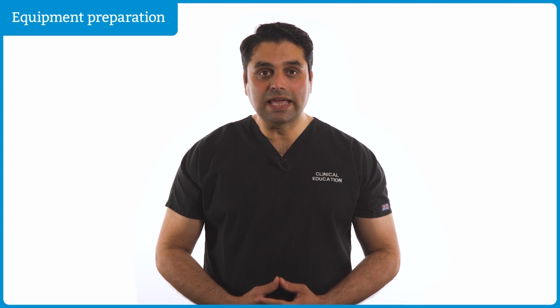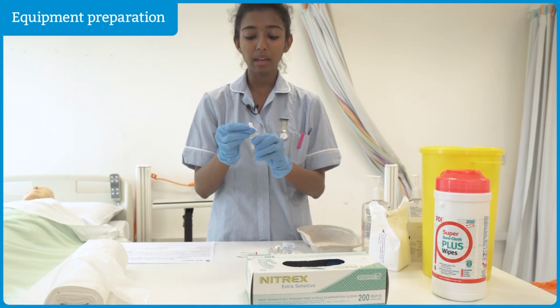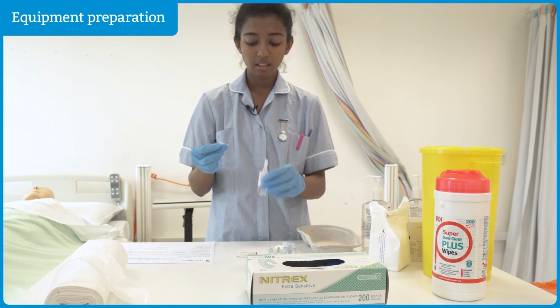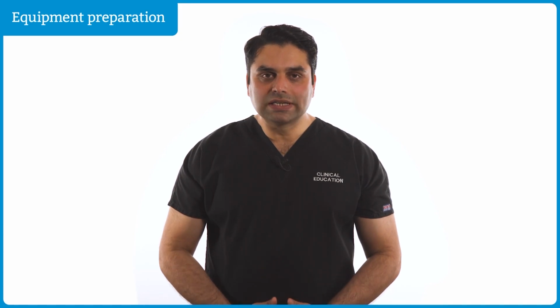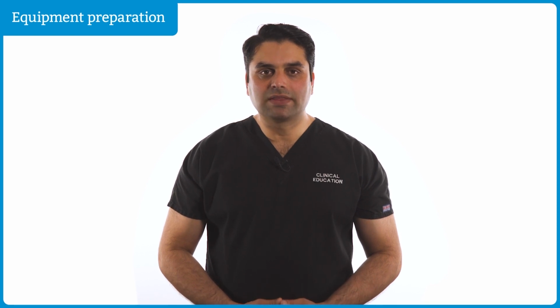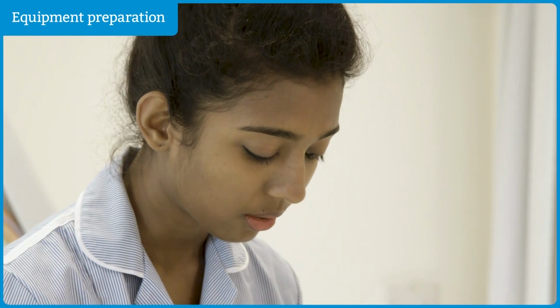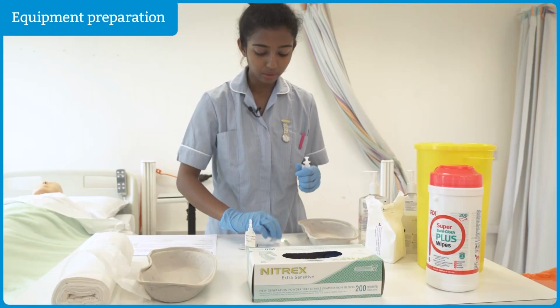Put on gloves and carefully clean the ampule with one of the swabs. I'll be cleaning the hub of the ampule for 30 seconds and allow it to dry for another 30 seconds. Fix the loading needle into the syringe and place in the clean tray. Now I'll be loading the injection. So I'll take the syringe, I'll take the loading needle.